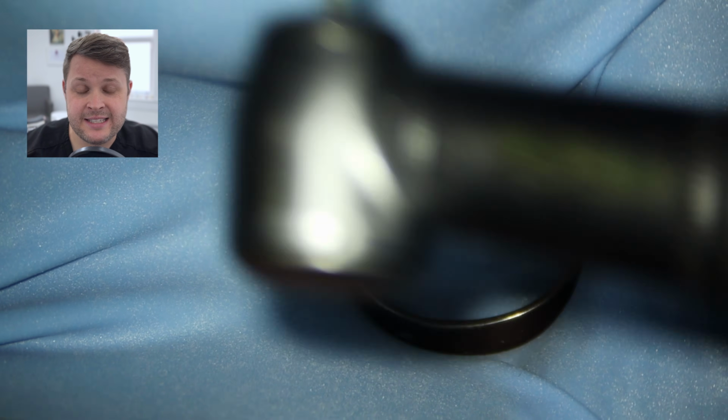And also the tooth is, I feel, quite long. Sometimes it's maybe irrelevant if the patient is made aware of that or not, but I think sometimes when a tooth is long, that can be more of a challenge to get to length. So these are all the things that you need to take into consideration. And of course, like I said before, what we've got to think about is restorability.